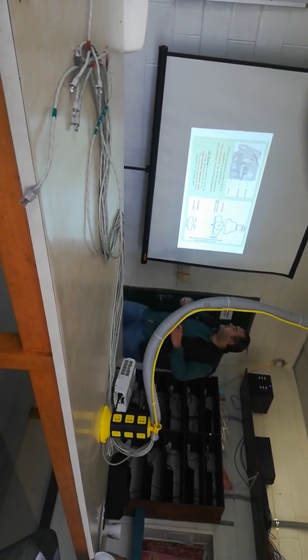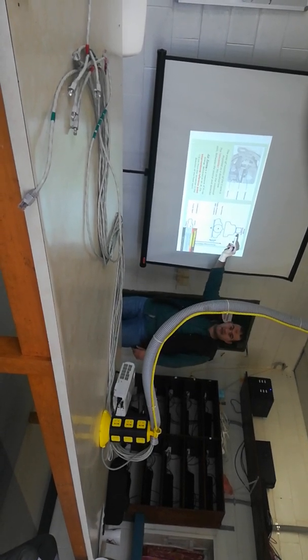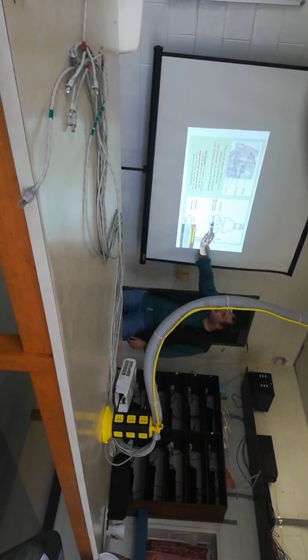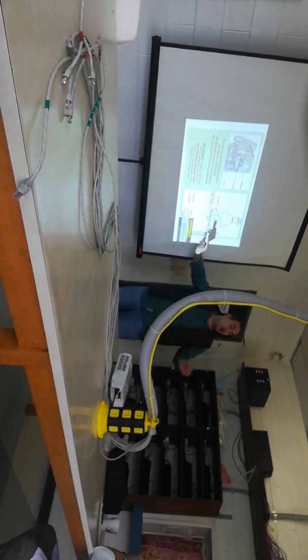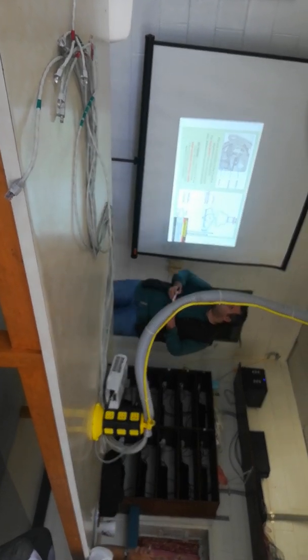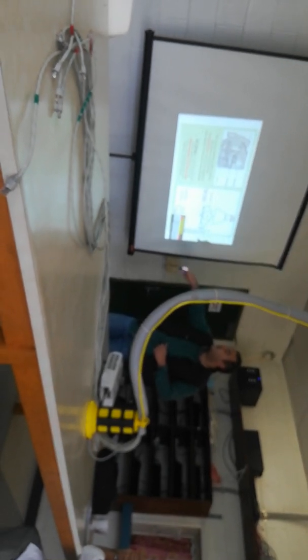As I told you before, the isocenter is between the image receptor or intensifier and the X-ray tube, 15 centimeters towards the X-ray tube. This point is the point for calculation of Kerma, kinetic energy released. So 15 centimeters from the isocenter in the direction of the focal spot.